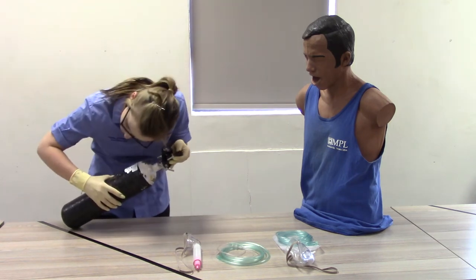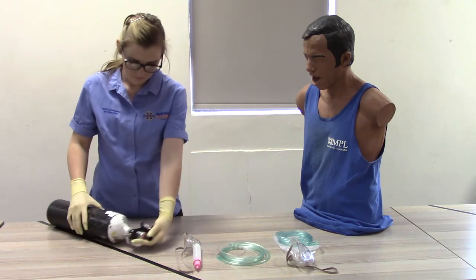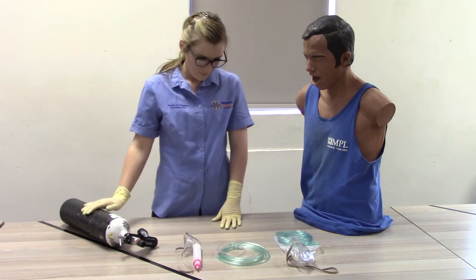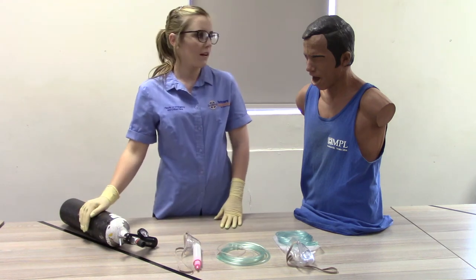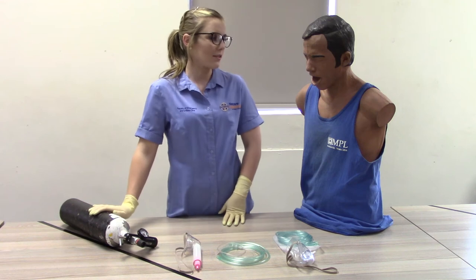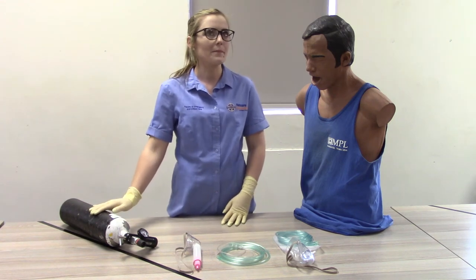Step 4: Application of oxygen delivery device. Explain the need for oxygen therapy and the procedure to the patient: "Hello sir, I'm going to place an oxygen delivery device on your face. It's going to provide you with extra oxygen to breathe."